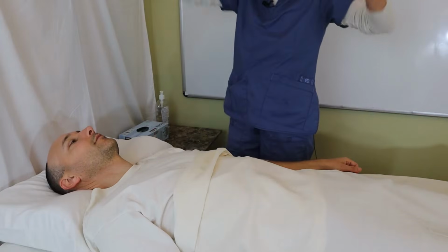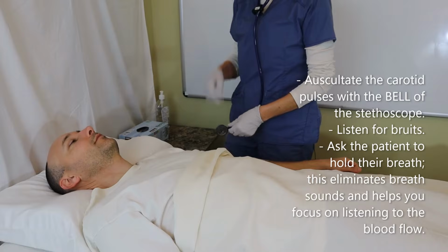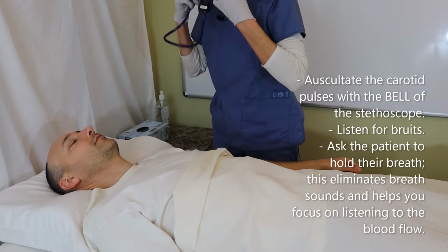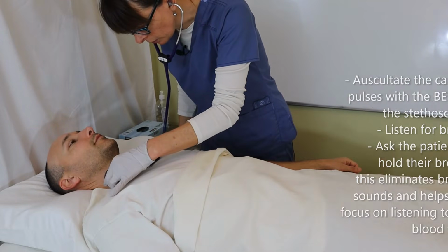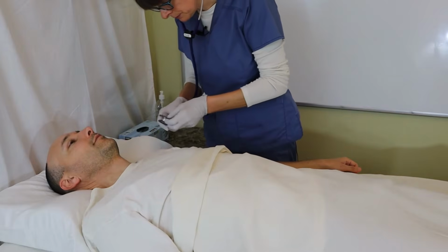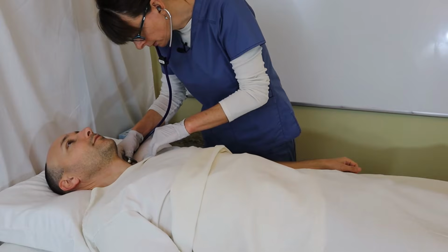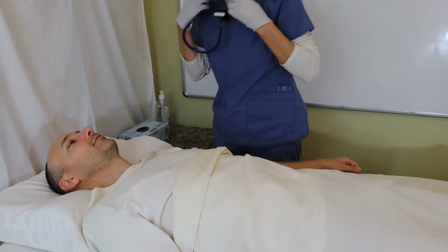Okay, good. Now I'm going to listen to your neck arteries here. And in order for me to hear better, I'm going to ask you just to take a deep breath and hold it when I'm ready, okay? Take a deep breath and hold it. Okay, exhale. Take a deep breath and hold it. Okay, good. Breathe. Thank you.